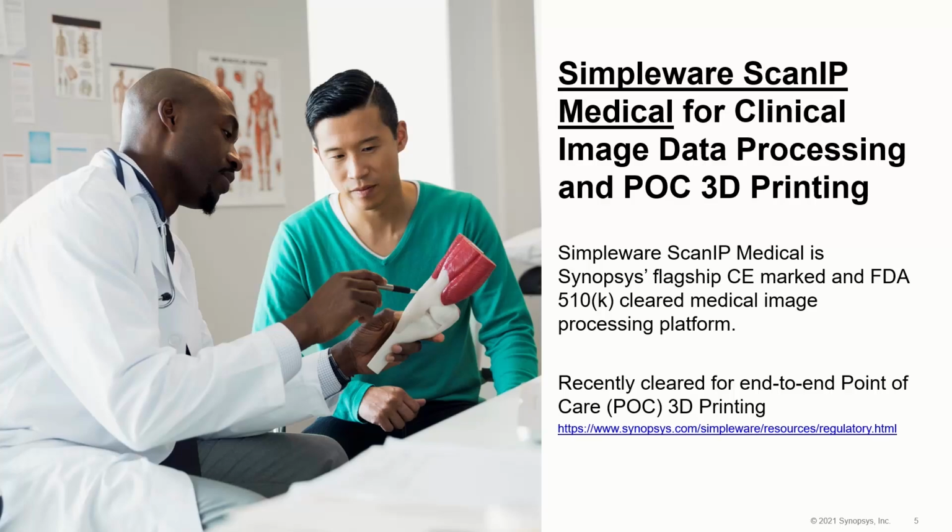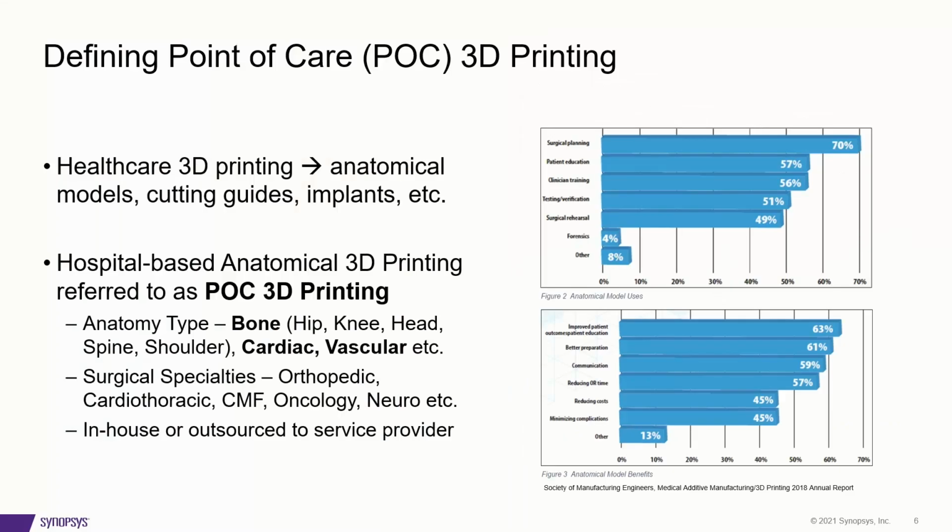Recently we have gotten clearance from the FDA for the end-to-end point-of-care 3D printing solution, and we have this on our website with all of our regulatory information and the 3D printers and their materials that have been cleared. So taking a quick step back, I just want to define point-of-care 3D printing for our current context today.